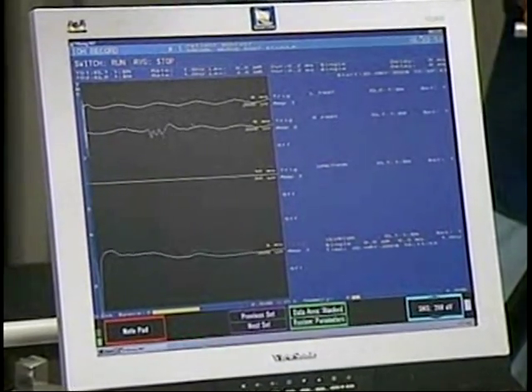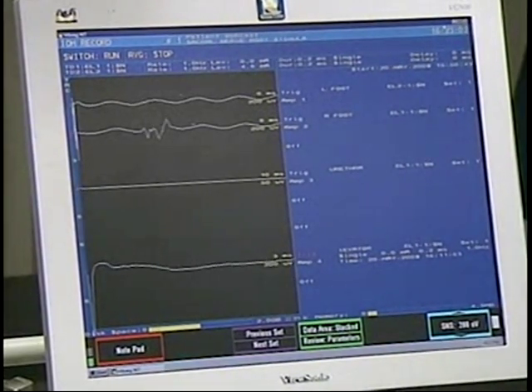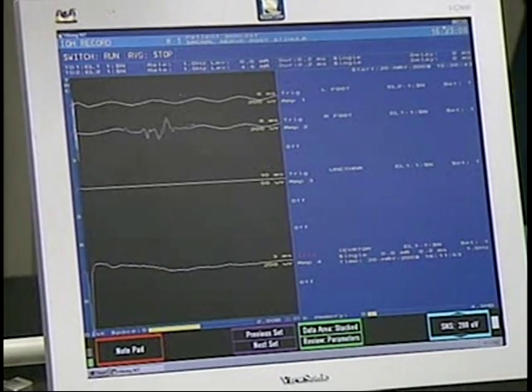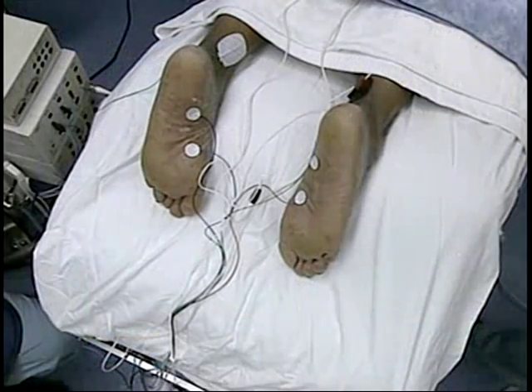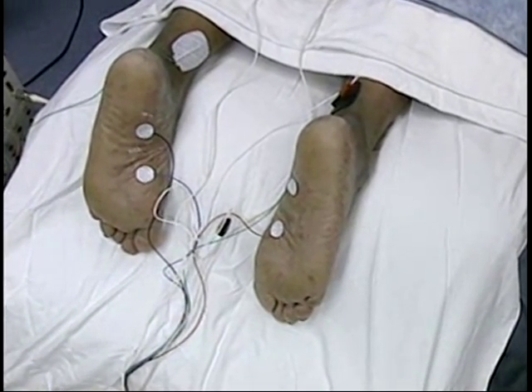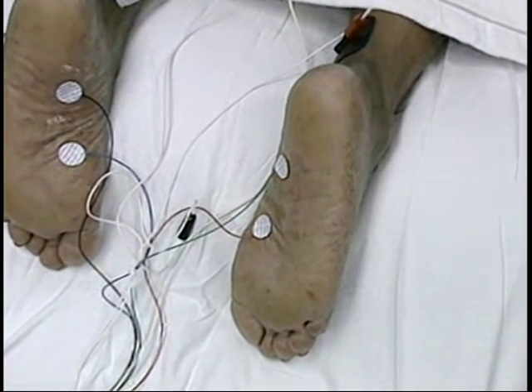What we're finding is the actual amount of stimulus required on the patient's right side is four times more than what we required on the patient's left side. We are getting very minimal toe movement and actually some rotation of his leg. If you look at his heel on the camera, we can see it tilting inward as the leg rotates. That's telling me we're getting an undesirable effect in terms of the amount of stimulation, so we're going to lower the stimulus.